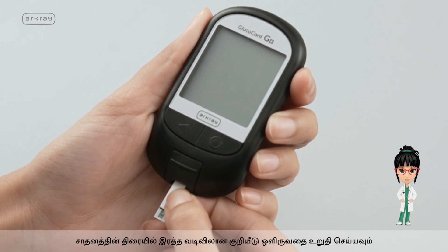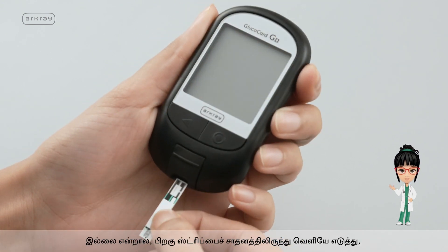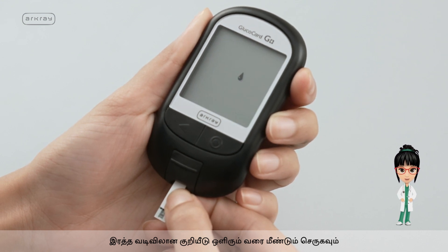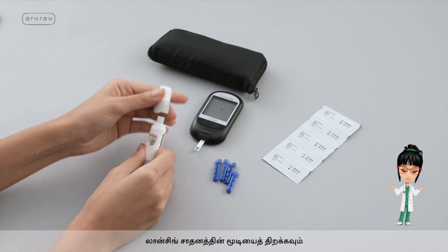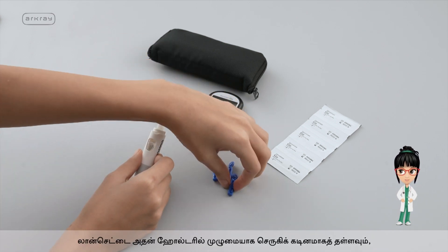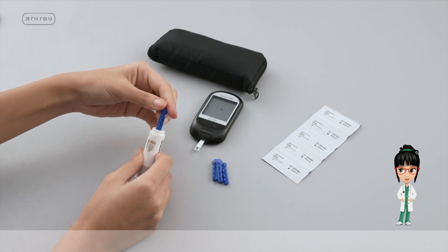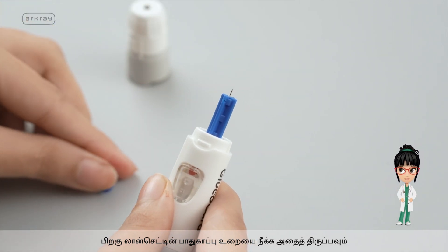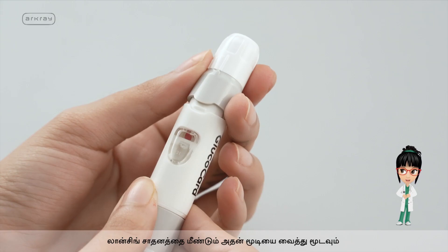Ensure that the blood symbol is flashing on the device screen. If not, take the strip out from the device and reinsert it until the blood symbol is flashing. Open the lid of the lancing device, insert the lancet into its holder fully and push hard, then twist it to remove the lancet's protective cover. Put back the lid of the lancing device to close it.